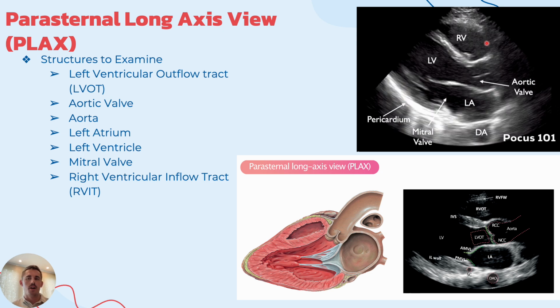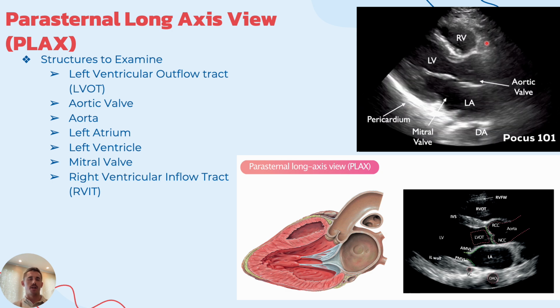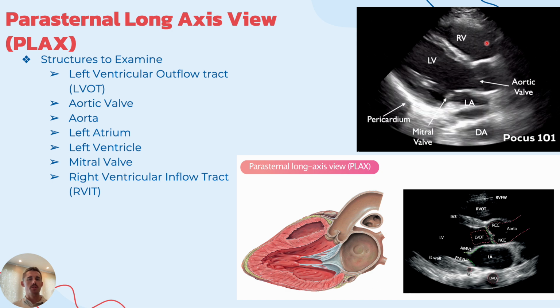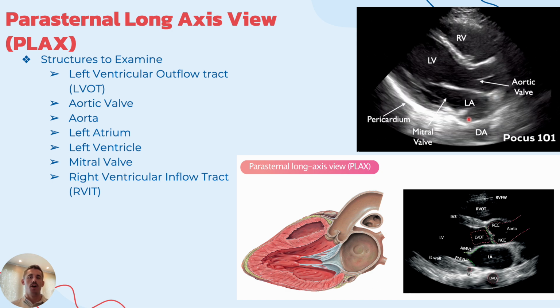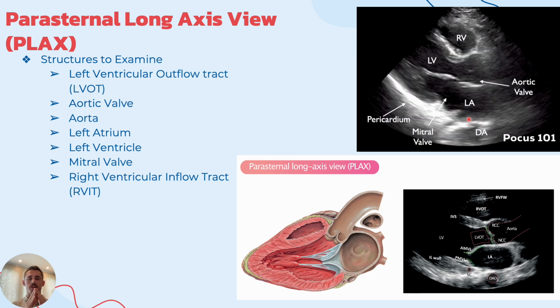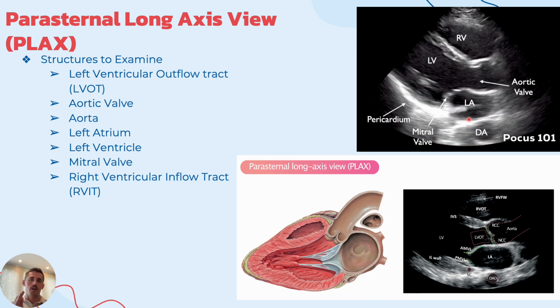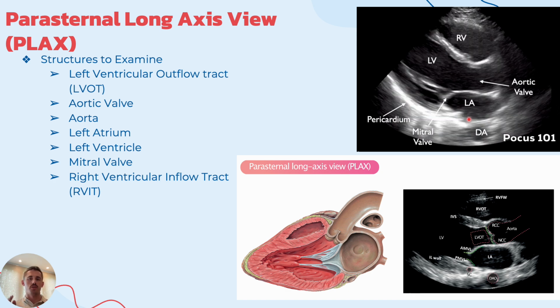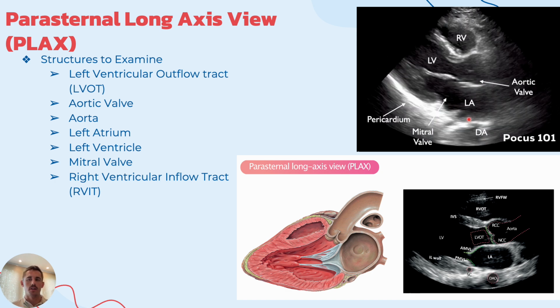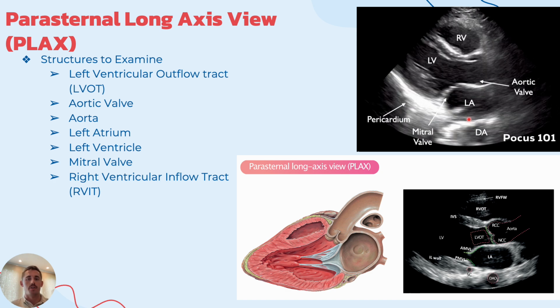What we're looking at is really, are the structures well defined? Are there vegetations that we can see, so anomalies of bacterial growth, or evidence of something like endocarditis? I want to see that the movements are uniform. So looking at something like the mitral valve, are both the leaflets coapting, aka coming together fully? Is one coming together more? And then are the muscles of the ventricles and the atria closing in and opening up in systole and diastole in uniform size relative to the time in the cycle and relative to the other structures?